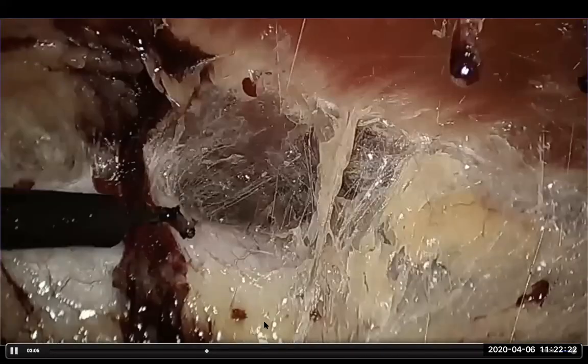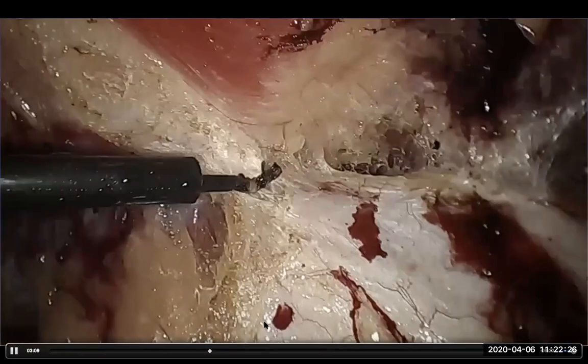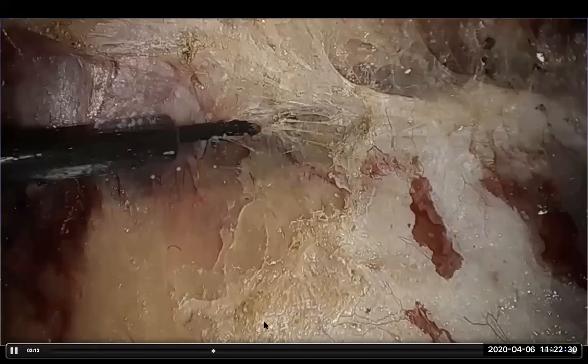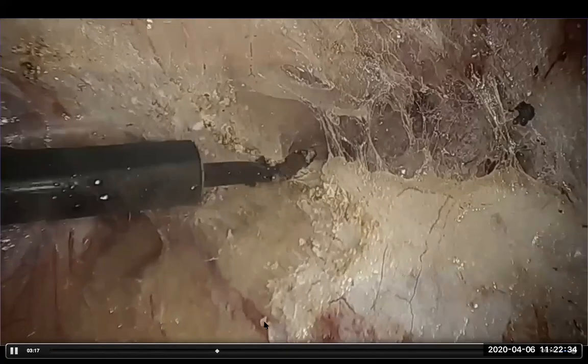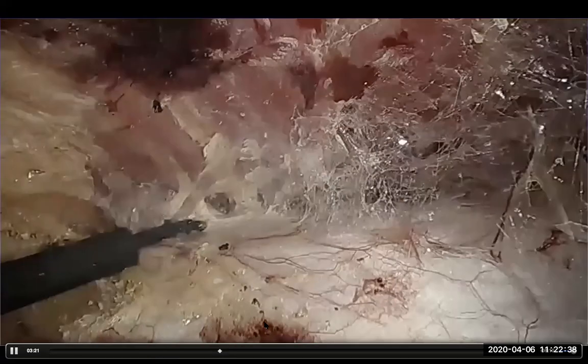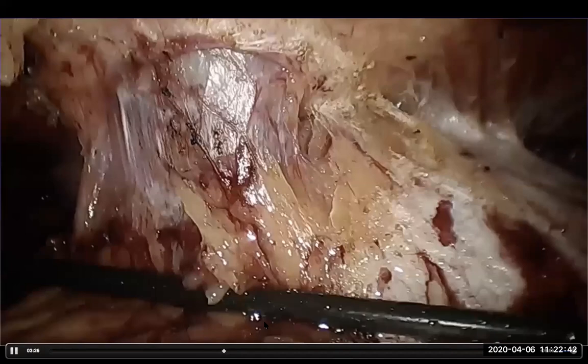So I hope you can understand what is happening here. We are keeping the peritoneal sac in the midline. We are dividing the posterior rectus sheath on the right and on the left, then creating a little bit of retrorectus space, and gradually conquering more and more territory in the bilateral retrorectus compartments.